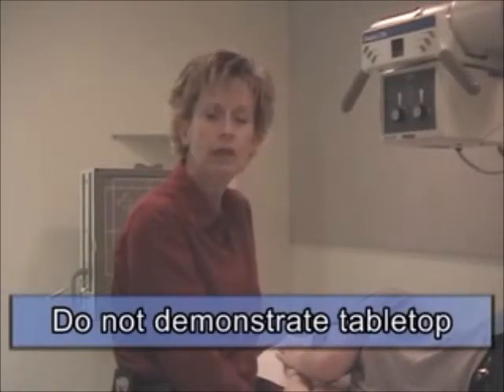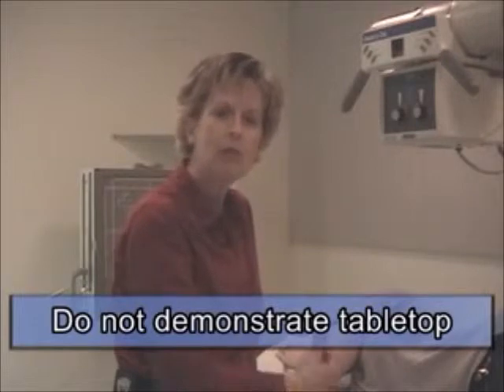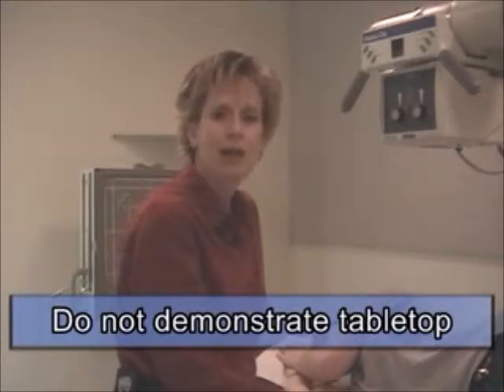So one of the things that we just experienced now is that your instructors, or you as a tech, are going to give you certain reference points. I'll recap that one in a minute. But if you ever X-ray tabletop, the rule is that's not valuable information. Alter your positioning. Do not demonstrate tabletop. Give the physicians the body to look at. Give them some GI to look at.